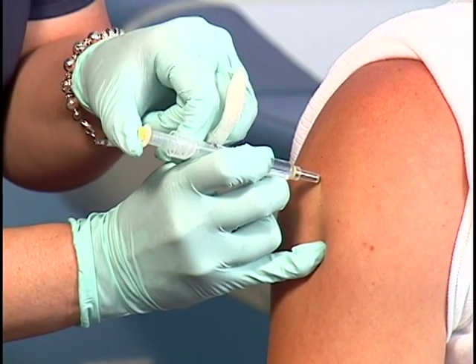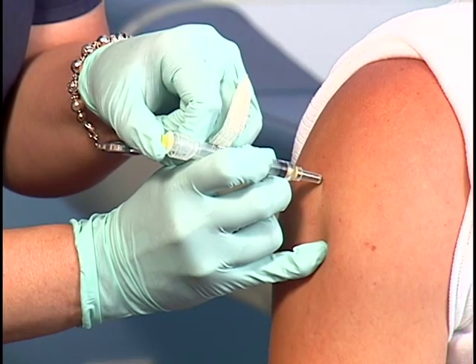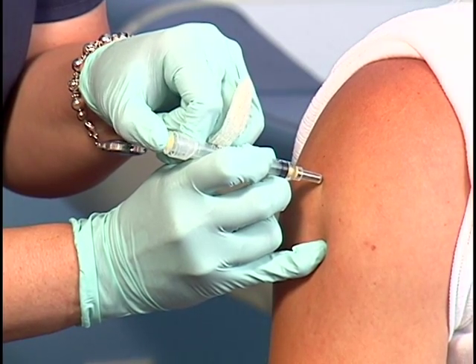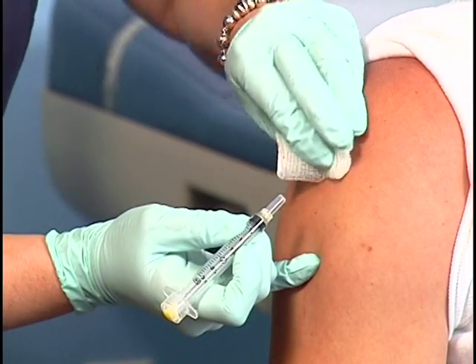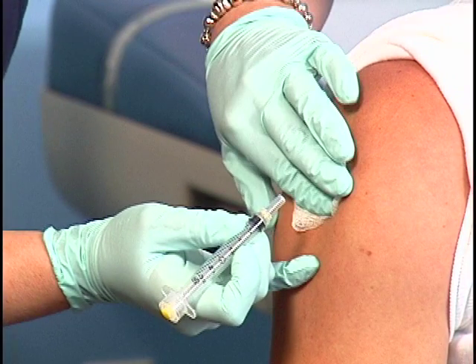Inject the medication slowly and steadily by depressing the plunger. Activate the retractable needle on the syringe by firmly depressing the end of the plunger. This causes the needle to automatically retract from the patient's tissue and into the syringe.